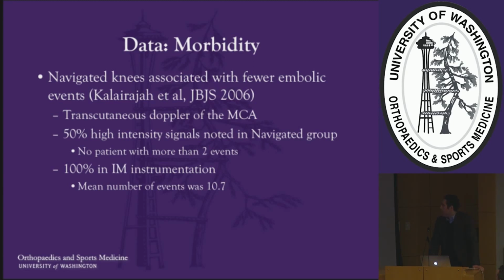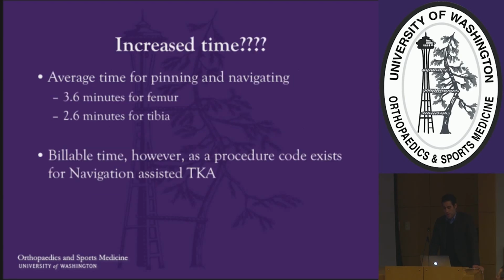Also, more data on morbidity. They did Dopplers of the cerebral artery, and you can see that with standard IM instrumentation, there's a lot more embolic events occurring. A lot of people knock navigation because they say that it adds a lot of time. The study out of UC Davis showed it really does not add that much time. Additionally, you can bill for navigation, and so it's billable time spent in the operating room, which is also important.